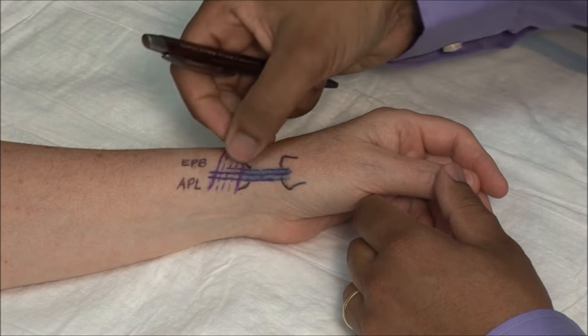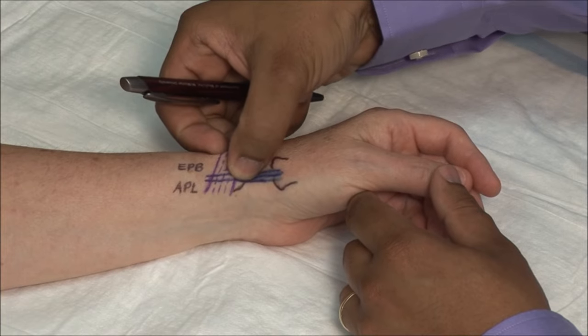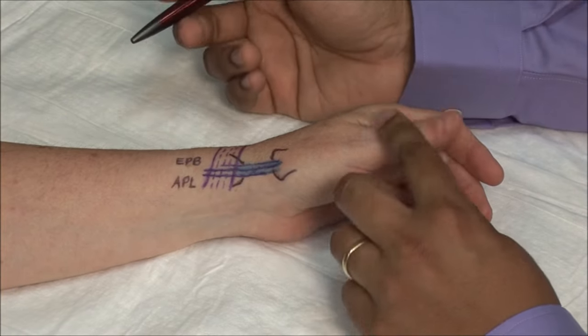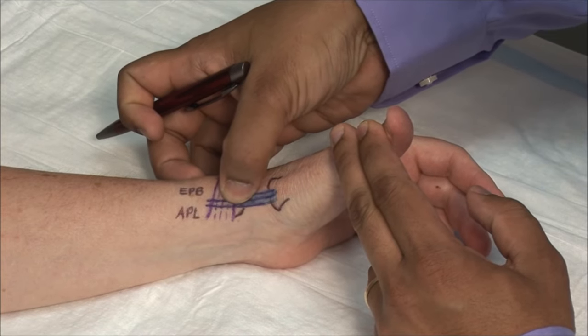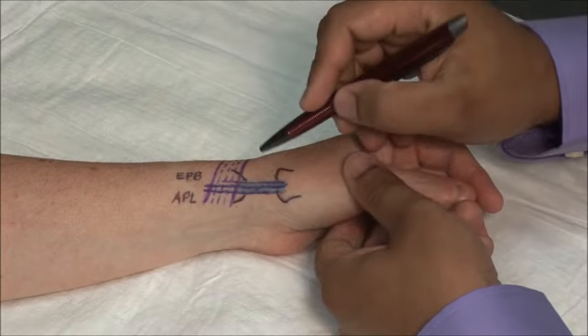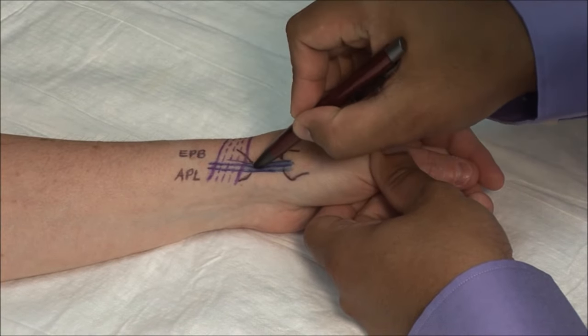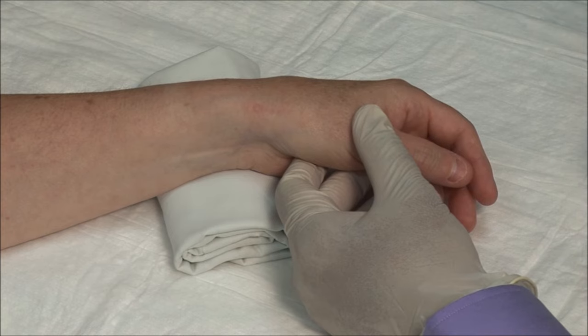Palpate the radial styloid and identify the tendons by having the patient extend the thumb against resistance. Then mark the point for injection. The injection is done with the wrist in slight ulnar deviation.